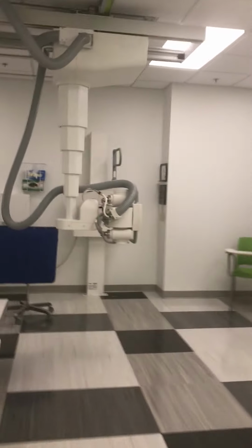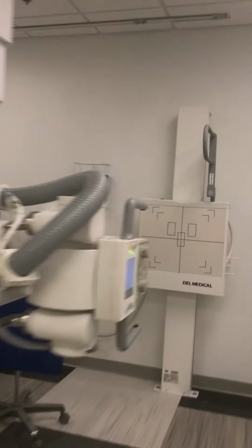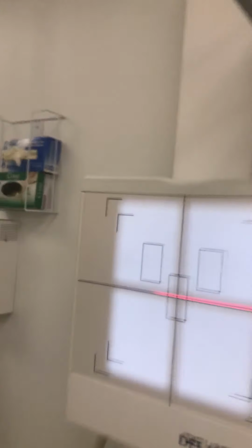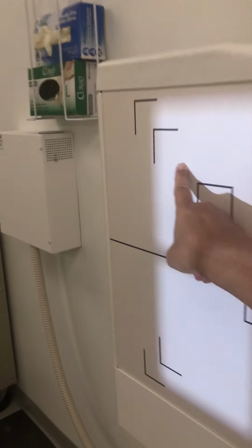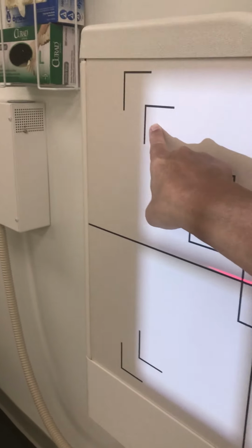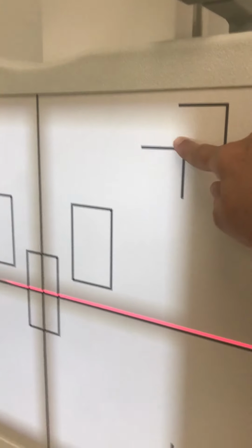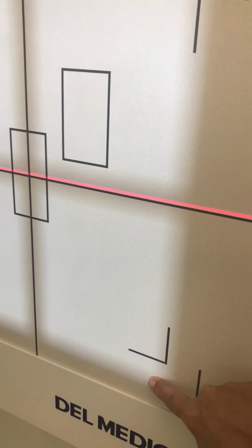Our collimation size automatically adjusts to that correct 14 by 17 inch size. 14 across, and 17 inches lengthwise.